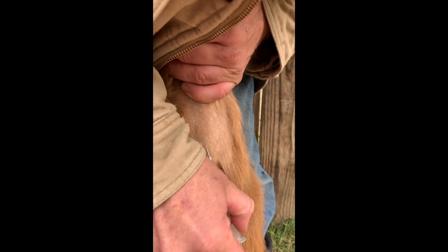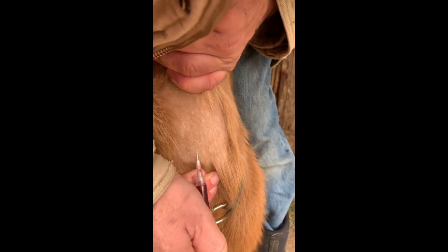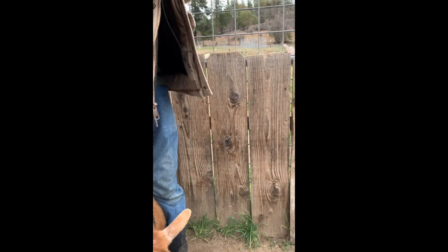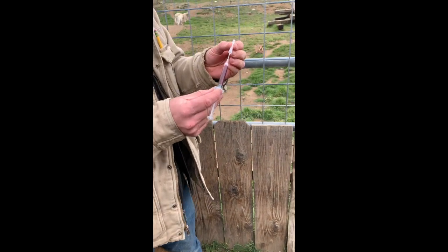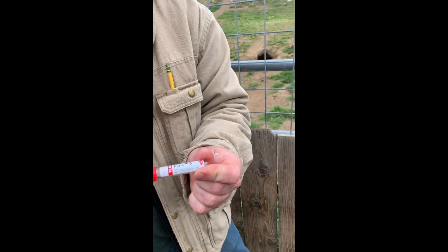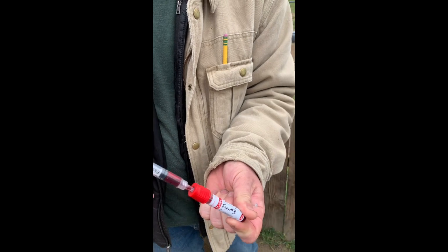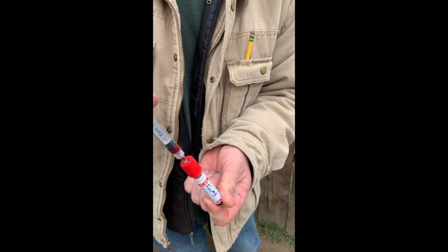The needle goes straight in — draw back on your syringe to make sure you're getting blood, and then you let go. Nicely done, we got a full sample there. The next thing we're going to do is put that sample straight into our red top tube, and you'll see it's actually a vacuum seal so it just pulls it right in — but don't overfill it.